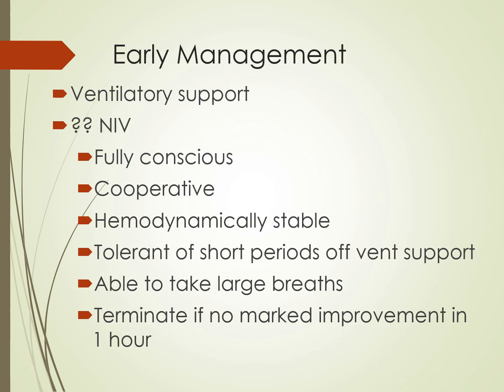Now let's turn our attention to early management of patients with ARDS. So you have a patient who was in a car accident, they have a blunt chest trauma. You do a workup with an x-ray, you start seeing opacities come in on the x-ray, you also see an increased ventilatory drive, and the oxygenation status based on the PF ratio is getting kind of poor. At this point, you may want to consider some ventilatory support.